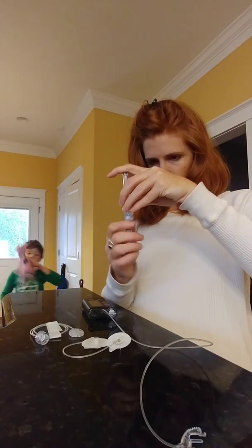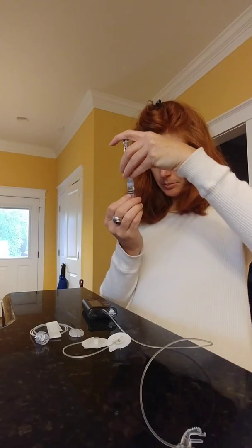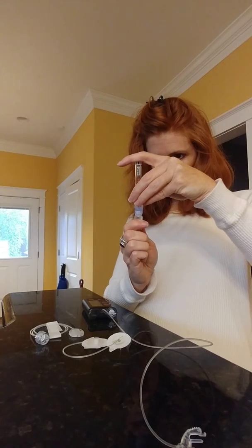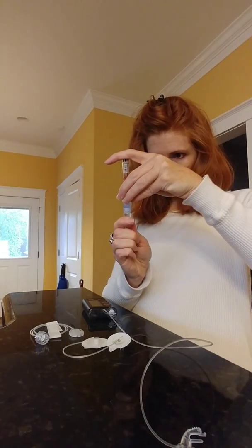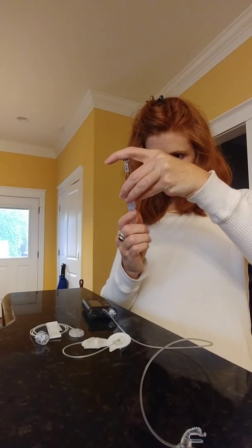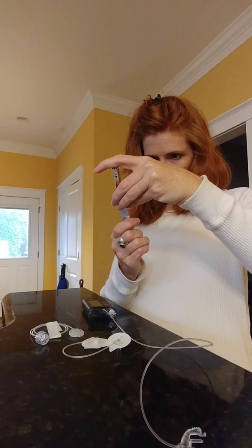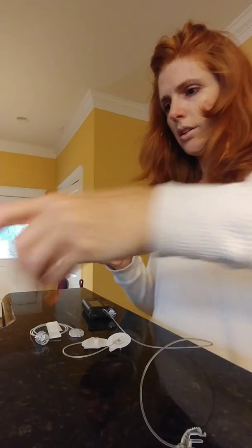Okay, so now if there's air bubbles in the top, I'm pushing the air bubbles out. And the more slowly that you pull the plunger back, the less likely you are to get air in there. 1 ml is 100 units of insulin, and I'm aiming for about 80 units, so I'm at the last hash mark there. Place your insulin down.